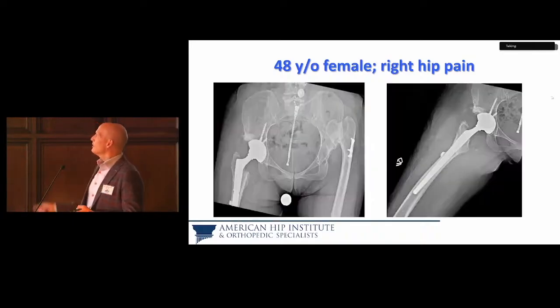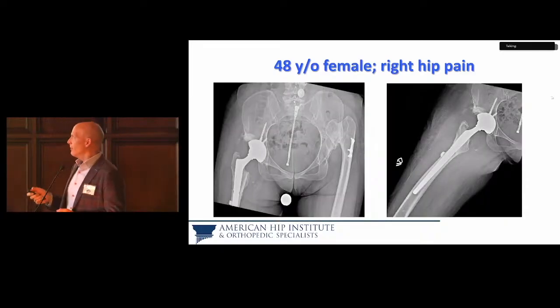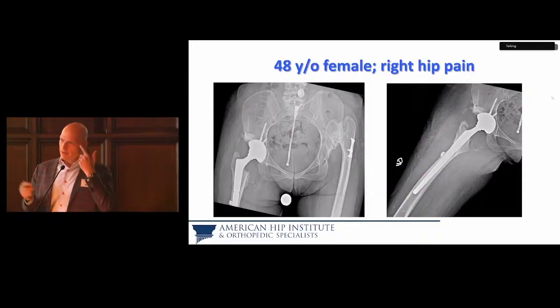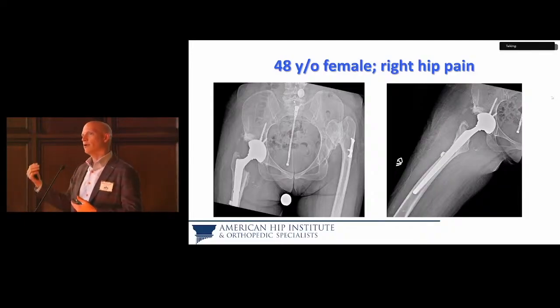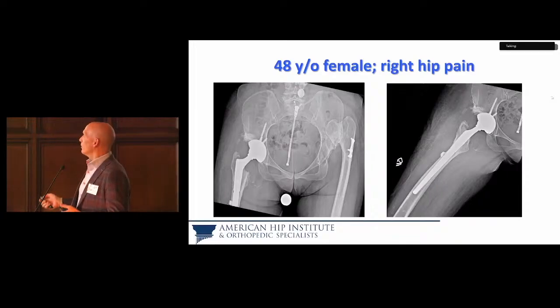But the reason I put this in here is I no longer could use my Wagner cone because I had to make a huge cortical window just to get that plate out. I had to take out all that cortical bone in order to get the plate out in order to get a stem down. So of course, put on a cable a little distal. You have to have backup. You have to feel comfortable using alternate implants. And again, one with a dual mobility to get her stable. We'll do our other side in a few weeks.